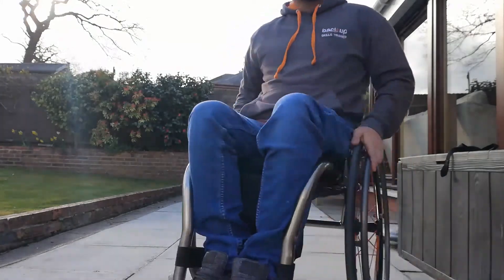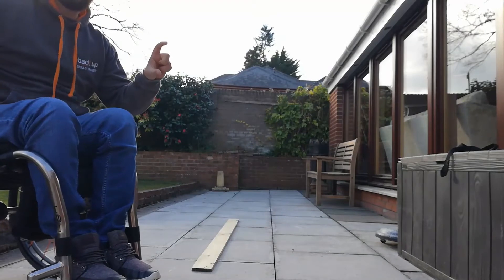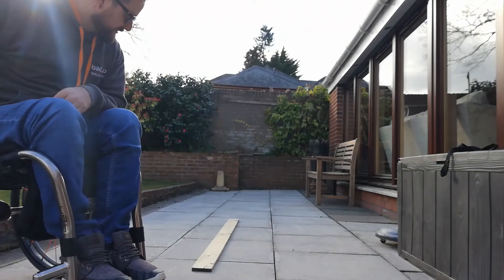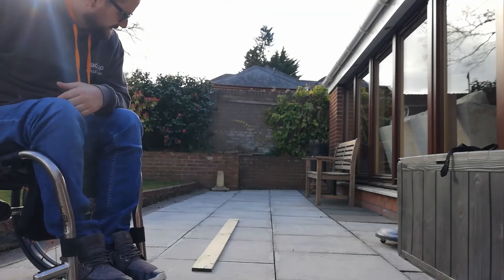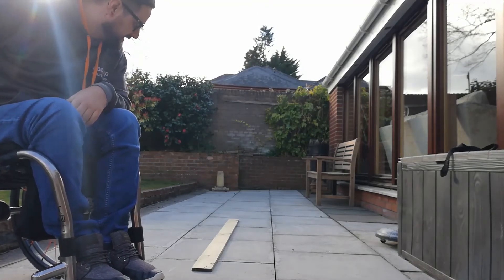We lean against the object on the other side before we put the caster wheels down. I've got a little bit of wood here — it's not very tall, and most thresholds would be a lot taller than this. But just for the purpose of the example, so you can see how the process works.